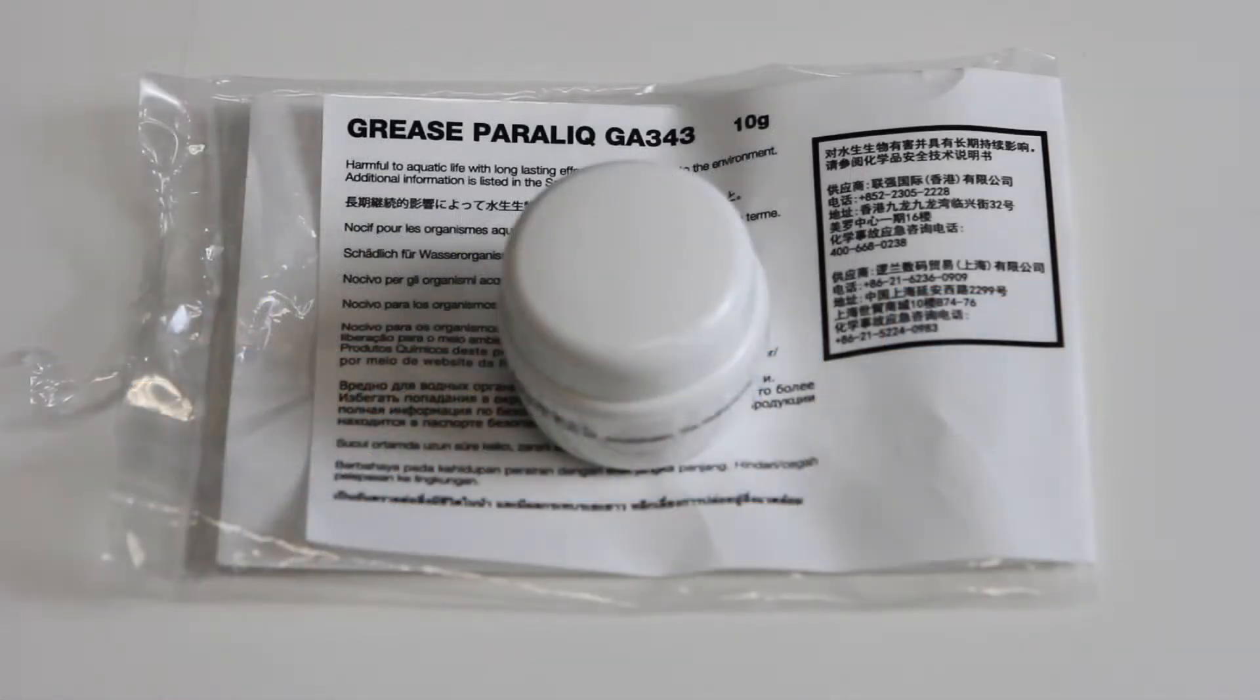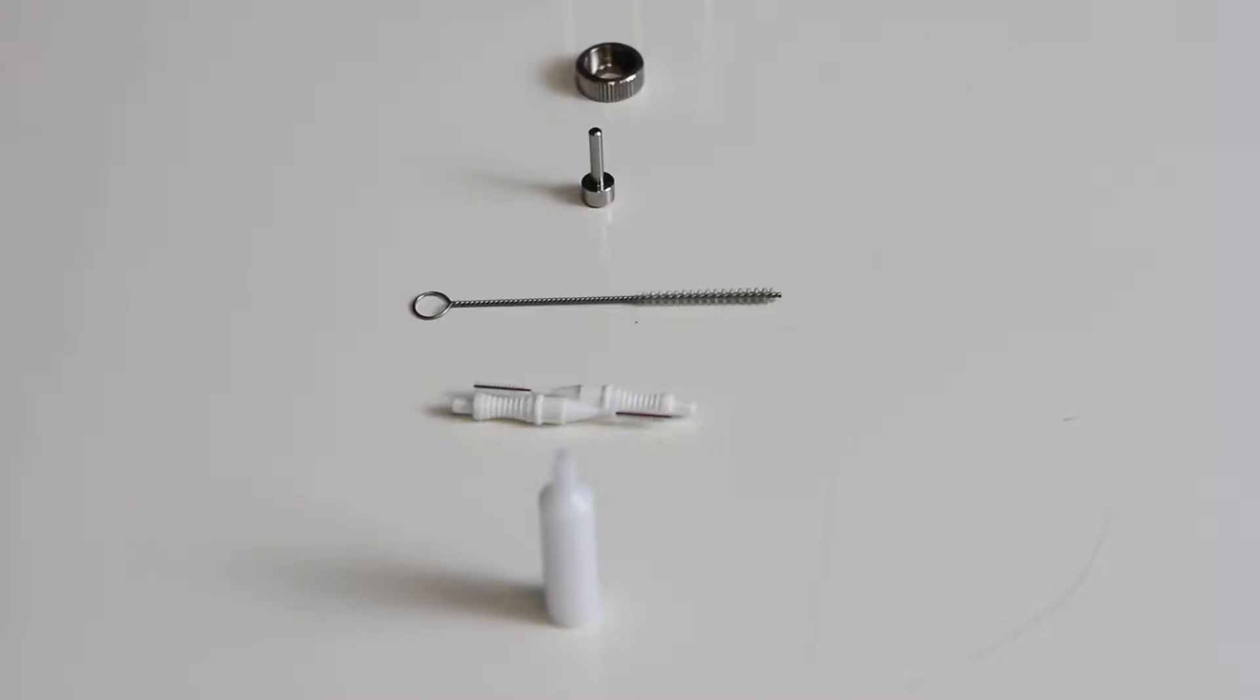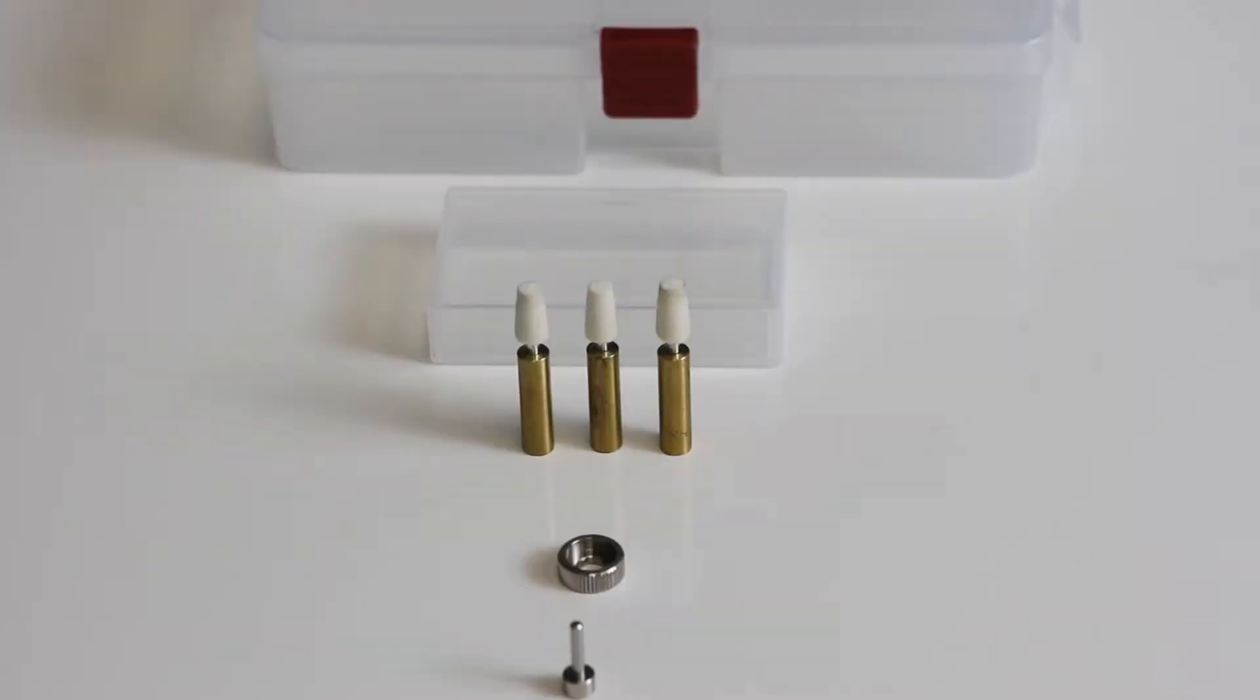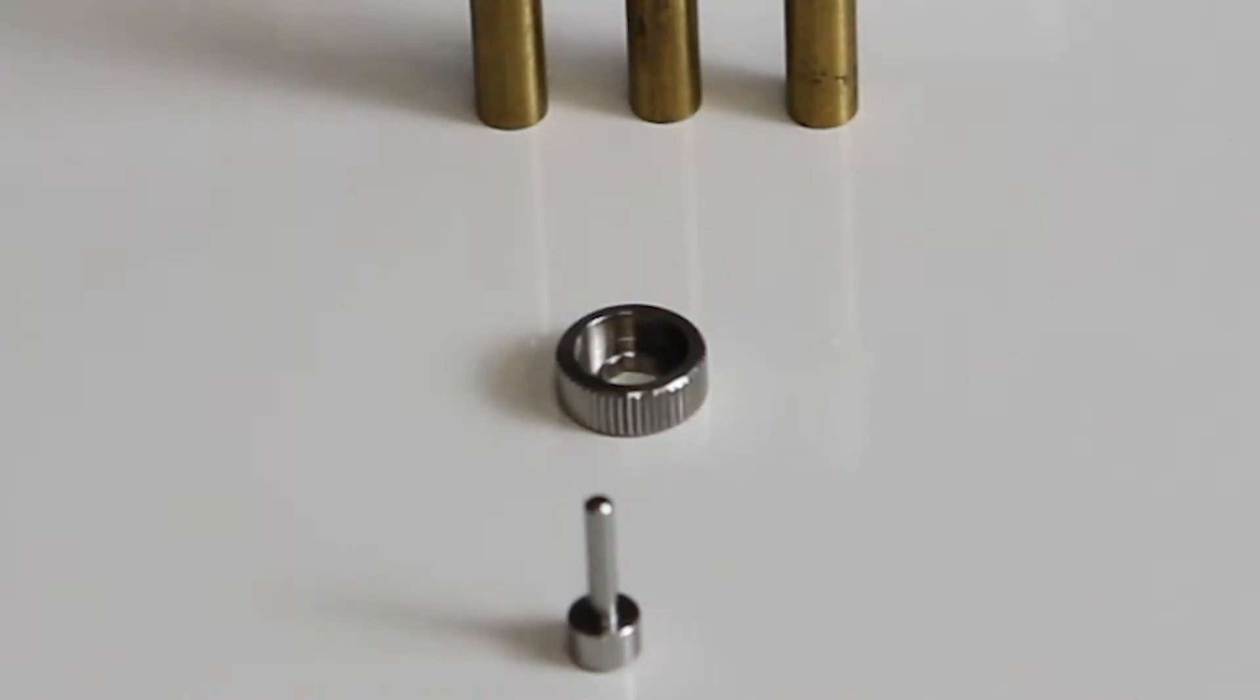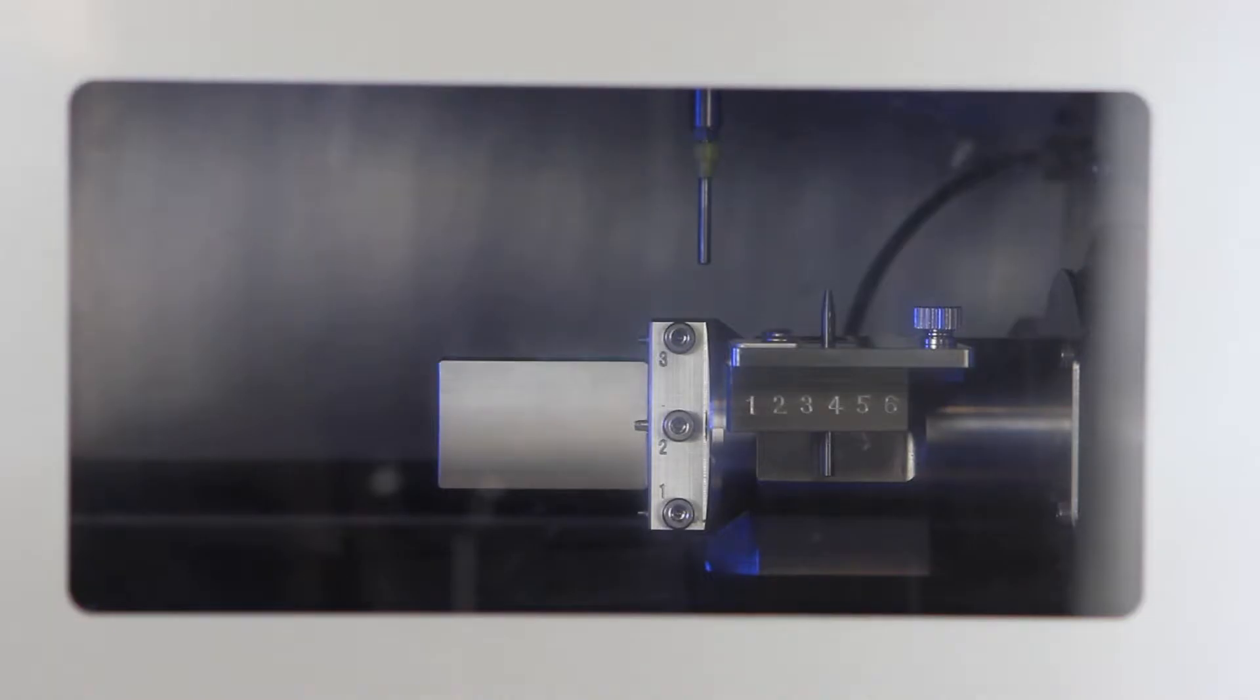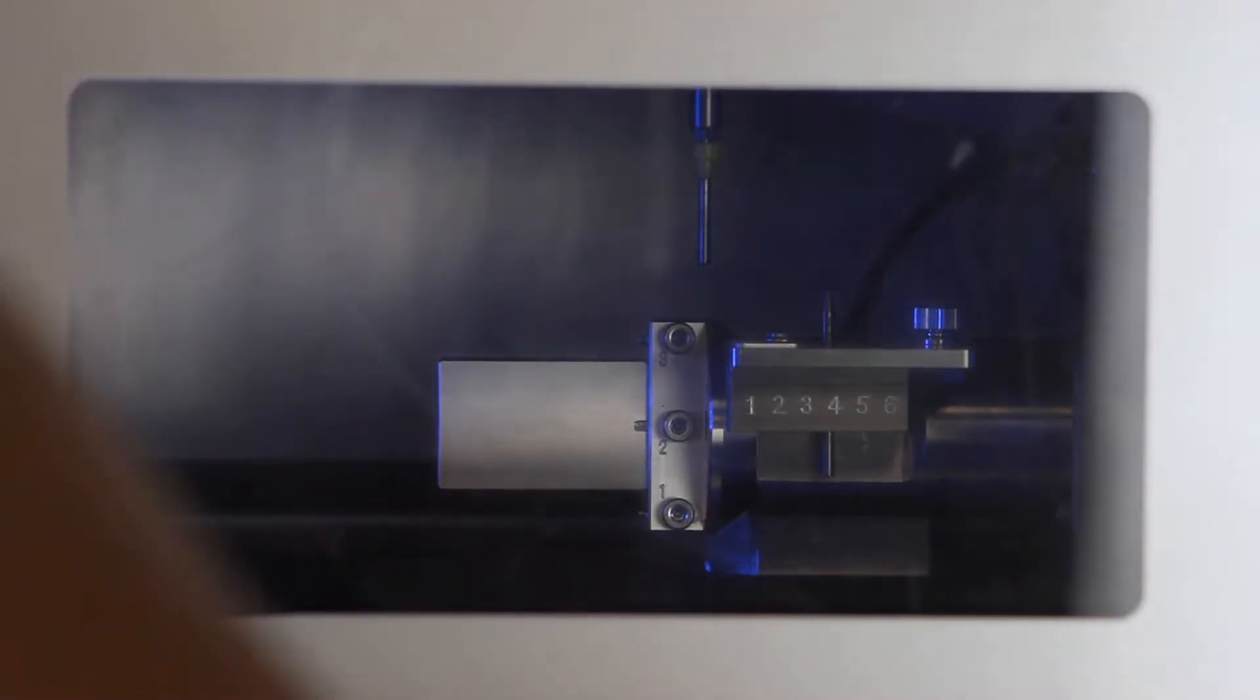To complete this step, you will need the collet maintenance accessories. This includes the collet grease, collet brush, nozzle cleaner, taper cleaner, collet tap, and collet replacement jig.